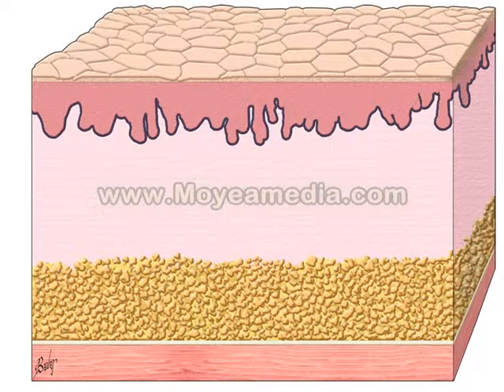The surface keratinized stratum corneum is a series of polygonal plates that connect in two dimensions. The rete ridges viewed from the undersurface resemble an egg crate, but in two dimensions form an undulating pattern.